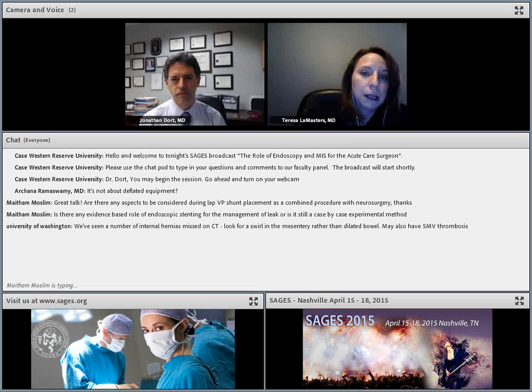But really, my take-home point on that is you need to look at the CT yourself. Swirl sign is great. Dilated bowel is possible. Look at the gastric remnant. If the gastric remnant is dilated and there's air in it, there's very likely an obstruction.